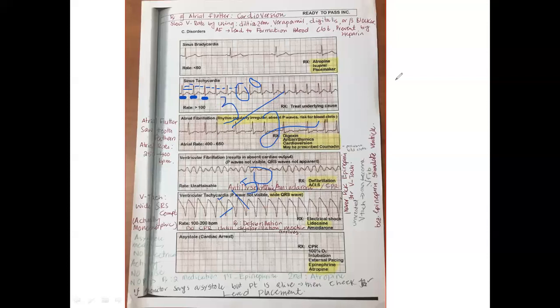So if our patient has a sinus tachycardia, what are the treatment options? Treatment, we better treat the underlying causes, right? So we have to find the underlying cause, and we have to monitor the patient if the patient has a sinus tachycardia. Another picture here, atrial fibrillation.